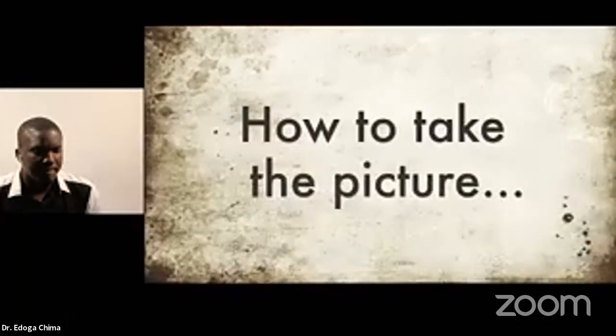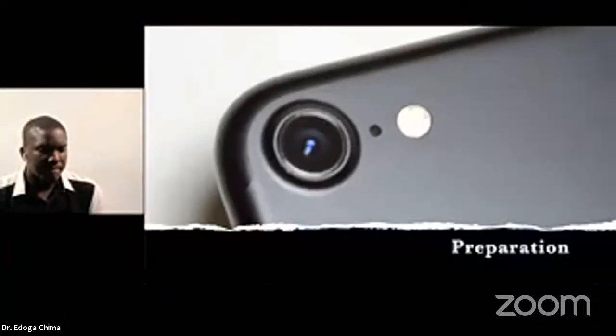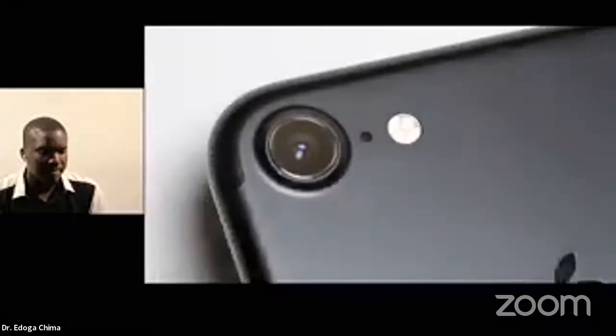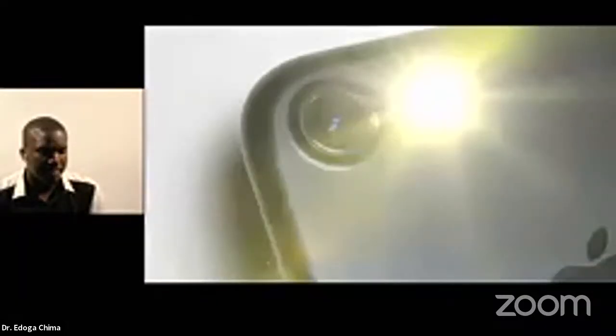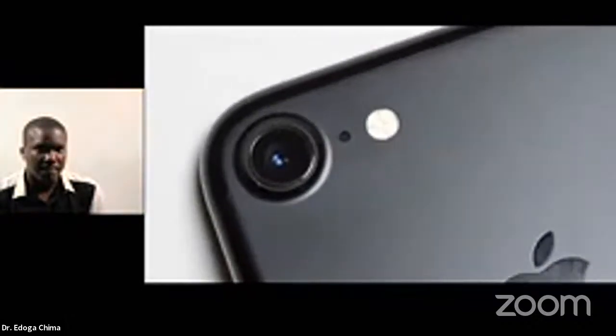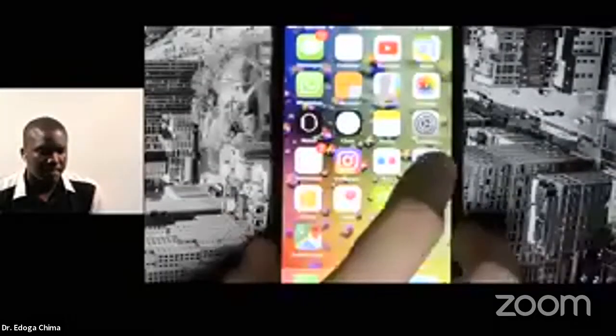How to take the picture. It is very important that the smartphone has a continuous LED flashlight just beside the camera. This is so that the light source is coaxial with the camera. I know it works with iPhone 7, 6, and 5, but in theory, any smartphone with a light source beside the camera should work. First, open the camera app in your smartphone, then switch it to video mode.